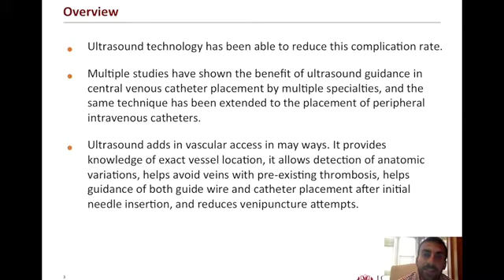In addition to that, the higher-level, more facile ultrasonographer would use ultrasound to facilitate the actual catheter placement itself, meaning that they would use ultrasound to visualize the tip throughout the procedure and ensure that they are in fact in the vessel of interest, along with the ability to even visualize the guide wire and its placement in the appropriate vessel of interest.